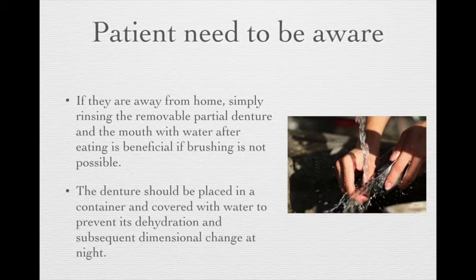Some patients may tell you they sometimes need to go out to join a dinner with their family. It's too hard for them to clean the denture and the teeth when they are away from home. So you just tell them the alternative is to simply rinse the RPD and the mouth with water after eating if they are not able to brush.